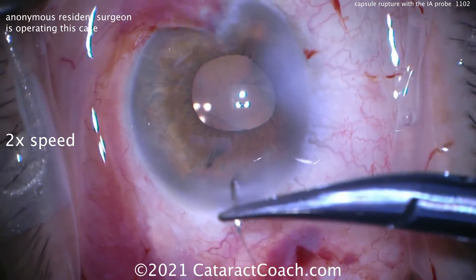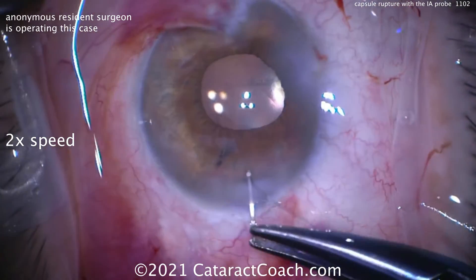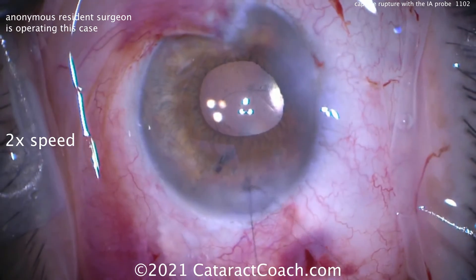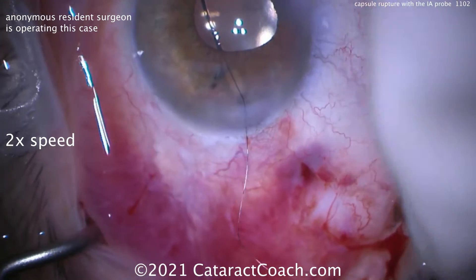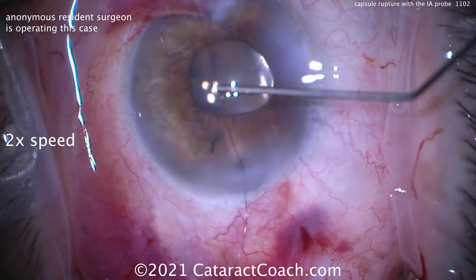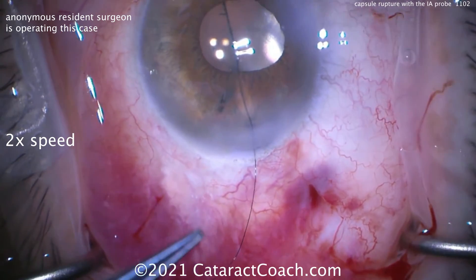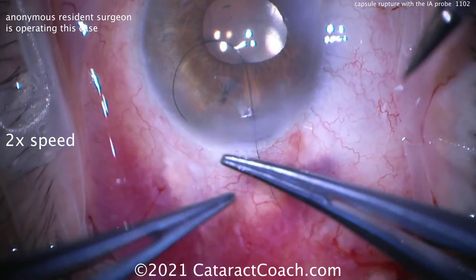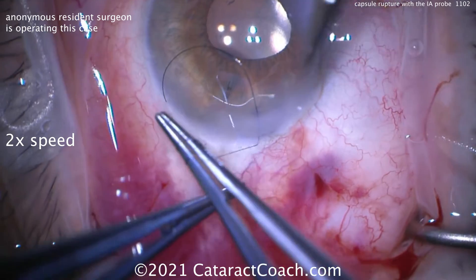Come on — 10-0 nylon, let's do this. You want the suture here, especially if you're a novice surgeon, because you don't need any extra grief in the post-op period. You don't need this patient to come back tomorrow with a leak of the incision. Remember, if this eye flattens out overnight, you could get vitreous prolapse — and there's no vitreous prolapse now. So let's just place the suture. This is the path of least grief, especially when you've done less than a few hundred cataracts.